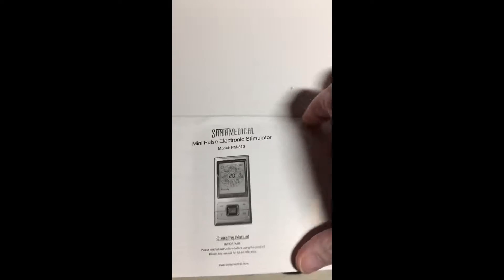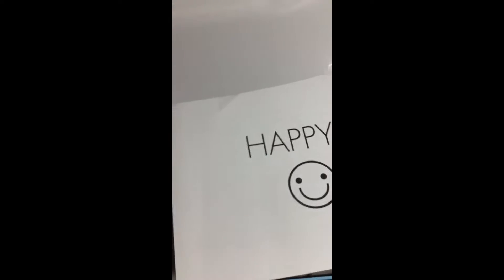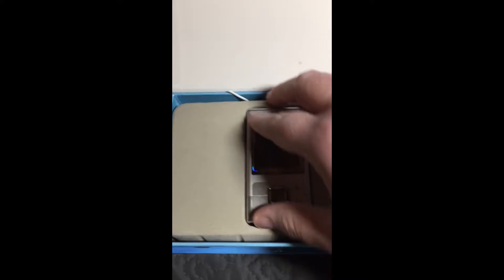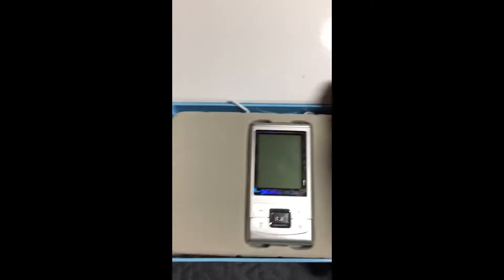That's all the specifics — I really don't know too much about the technical side. You have your instructional manual and a little note for when you buy it. Now we get into the nitty gritty: I have used this several times and I really, really do like it.